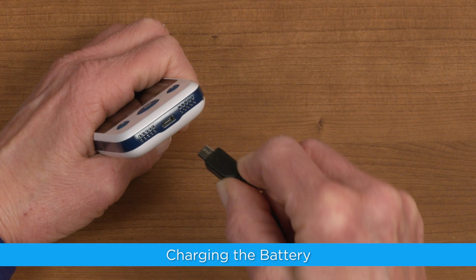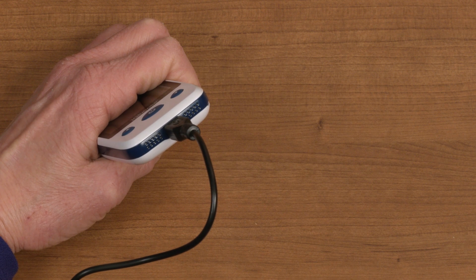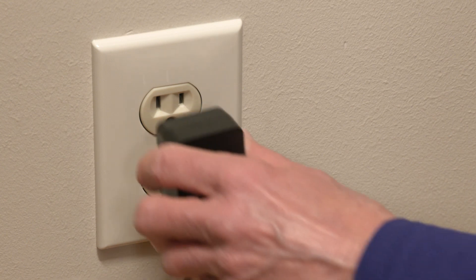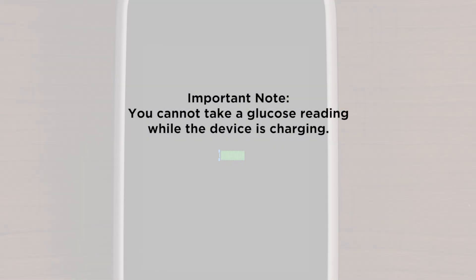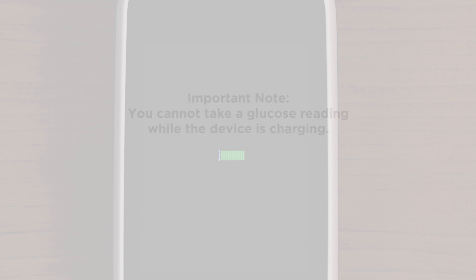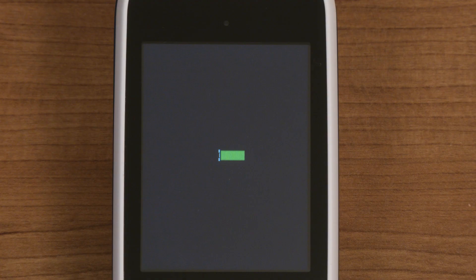To charge the battery, insert the mini USB charging cable into the charging port at the bottom of the meter and plug the AC adapter into an outlet. When the meter begins to charge, a blue light will appear above the screen and the screen will light up. On the screen, you will see a charging battery icon. Note that you cannot take a glucose reading while the device is charging. It may take 2 to 3 hours to fully charge, so it may be helpful to charge your meter at night or in between your typical testing times. When charging is complete, the battery icon will be solid green.